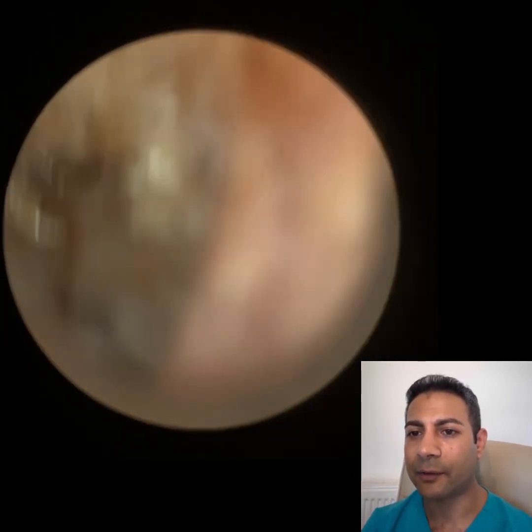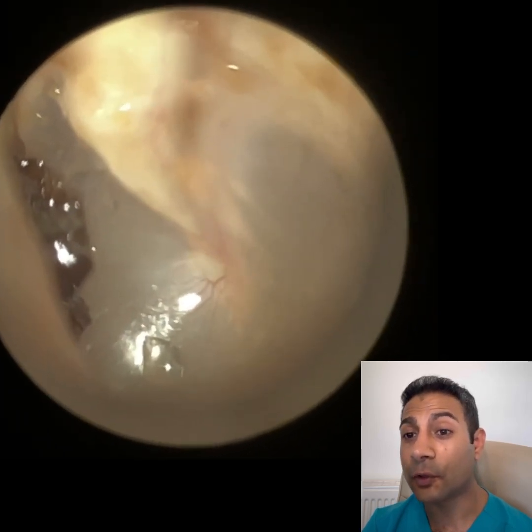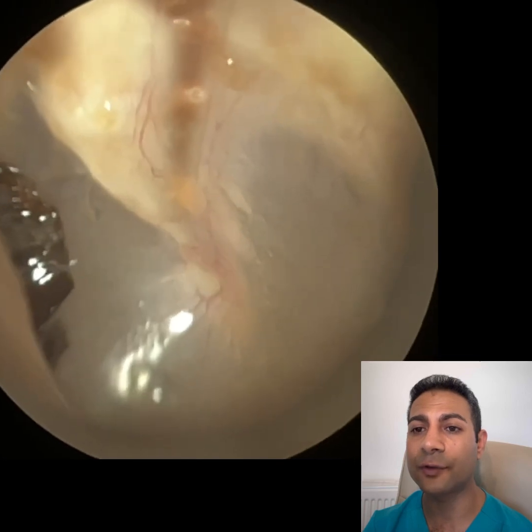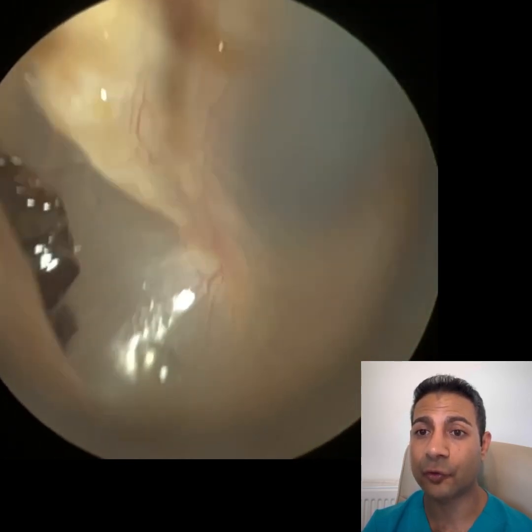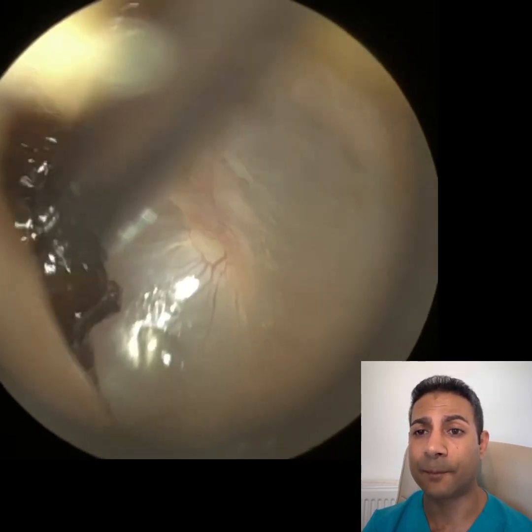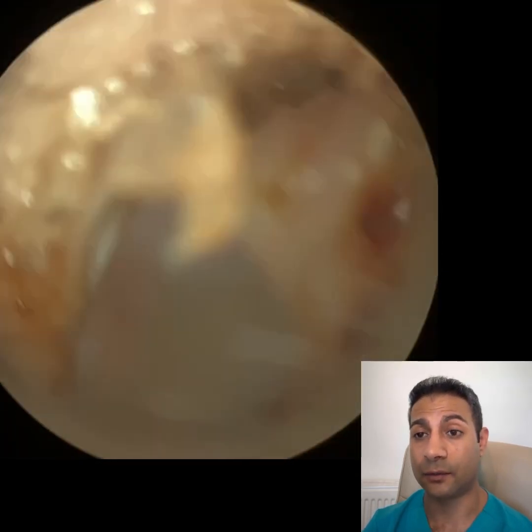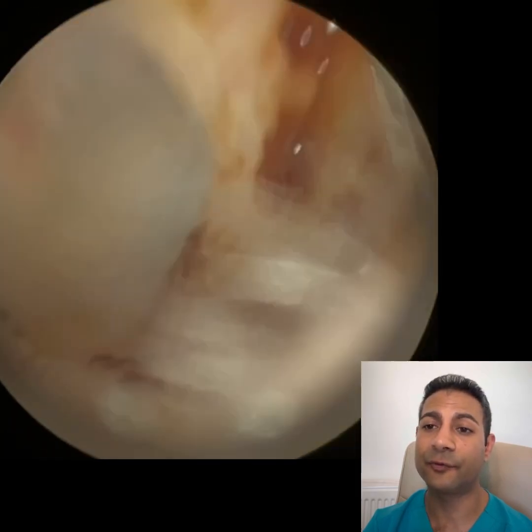So there's that bit of wax that I was referring to in the anterior recess. It doesn't look a lot, does it? But we've zoomed in using the WAXscope. I'm just going to get it in focus and just going to use a 17 gauge suction tube. I prefer that over the 18 gauge now. It's still got a narrow tip, but it's just a bit more powerful without any excess additional noise. So yeah, as you can see, there's a tremendous amount of wax hidden away in the anterior recess.